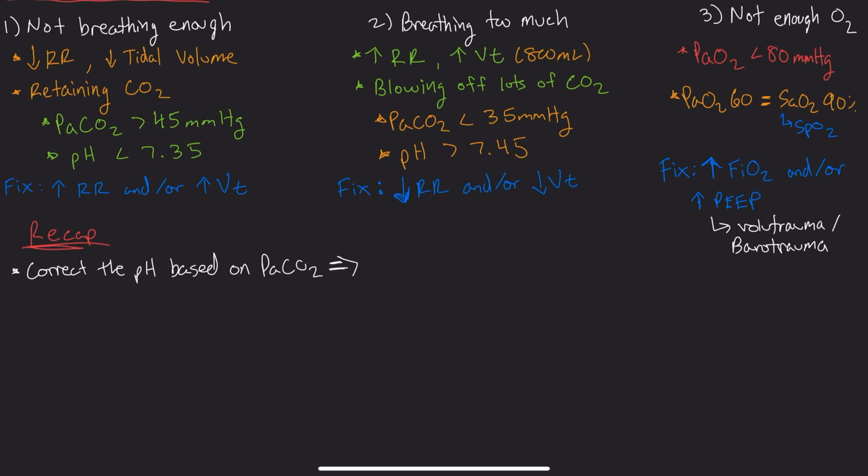You can either increase or decrease respiratory rate and/or increase or decrease the tidal volume.